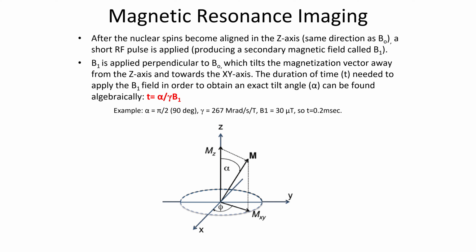They're all going to sum up into a main magnetization vector called capital M that points directly in the direction of Z. So even though the protons individually are lining up at 55 degrees to the main magnetic field, the net sum of all those protons is still going to be in the exact same direction as B naught. So that's the capital M vector.